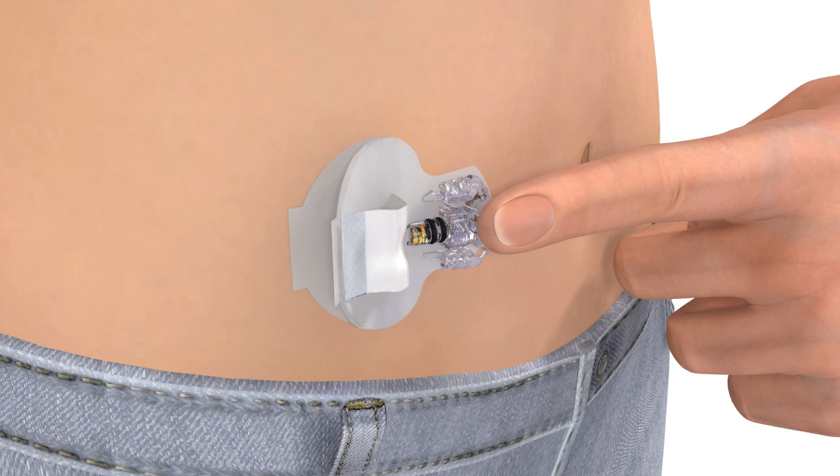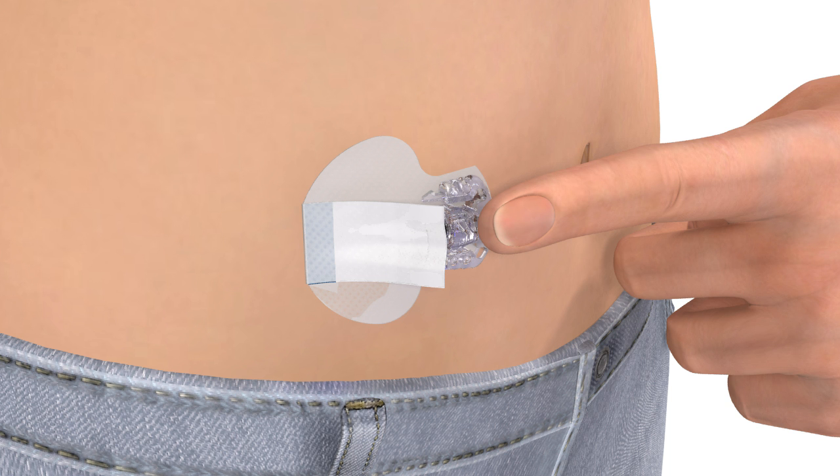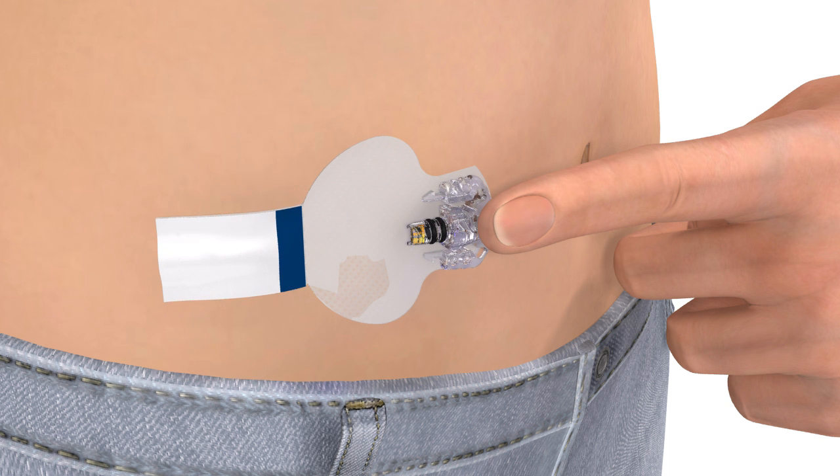Carefully remove the paper backing that is located underneath the curved adhesive pad. Press the adhesive against the skin. Flip the adhesive tab so that it lies flat against the skin, but do not remove the paper backing just yet.